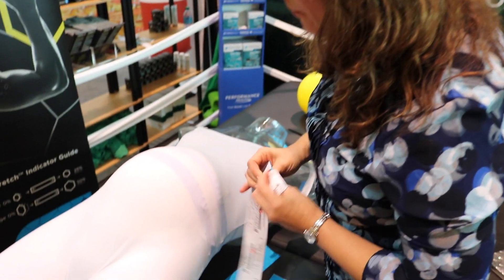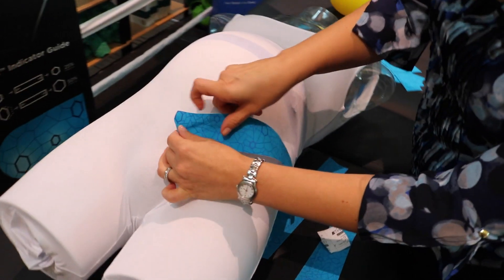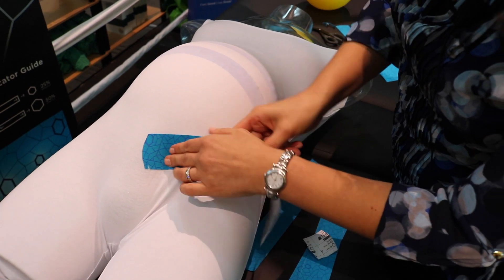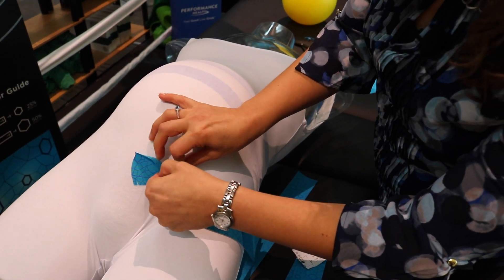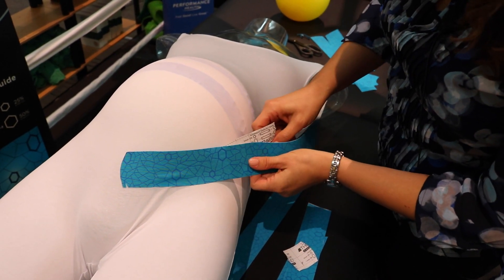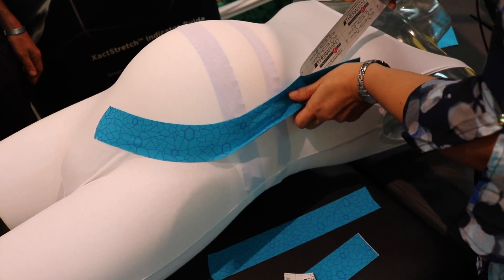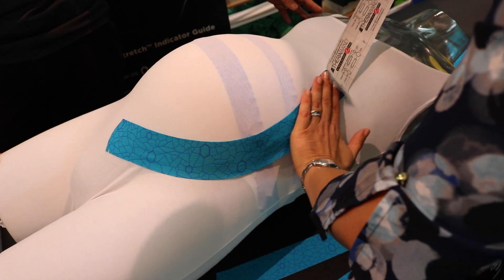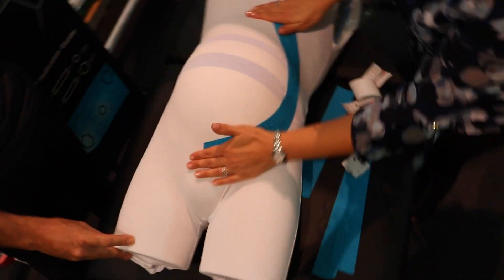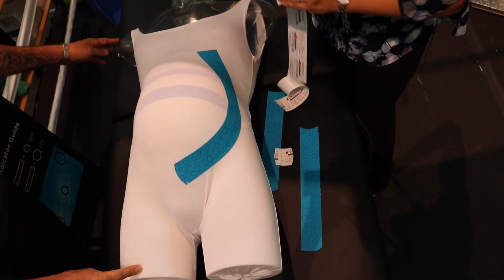Pretending this is our pubic symphysis, we start with our anchor. As we get ready to tape and lay down, we activate the tape — so that's our first strip. The next strip we're going to do the same thing on the opposite side.